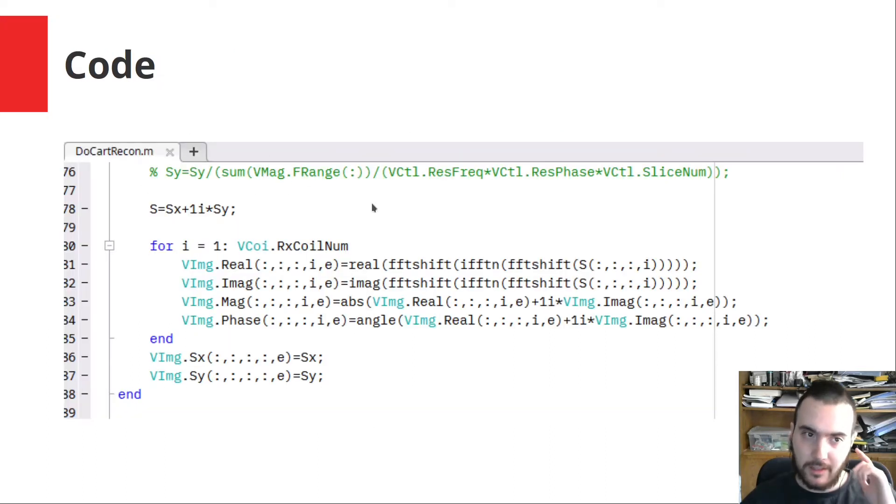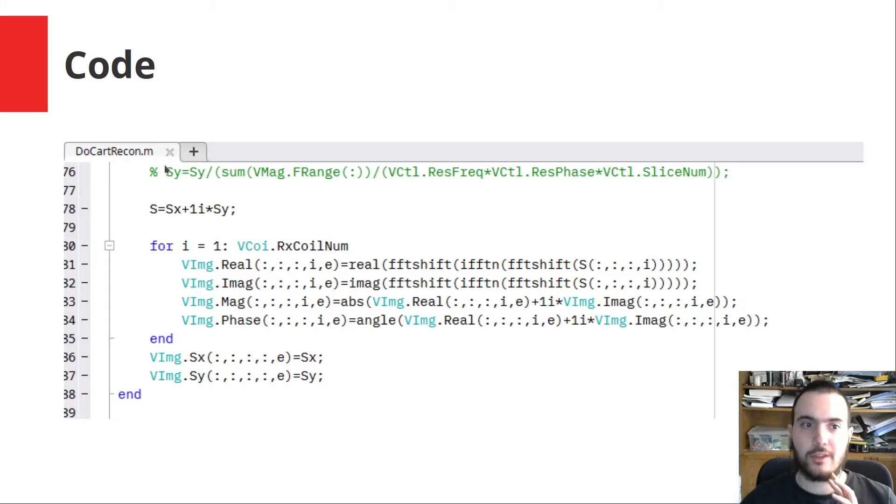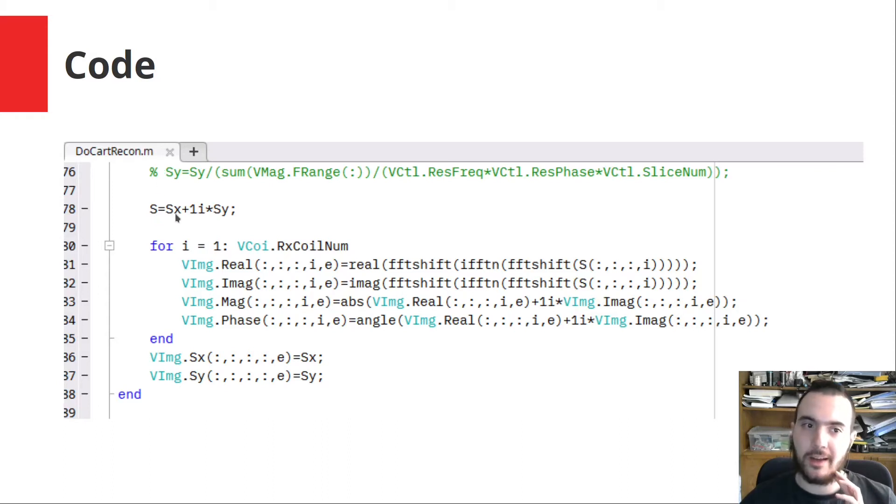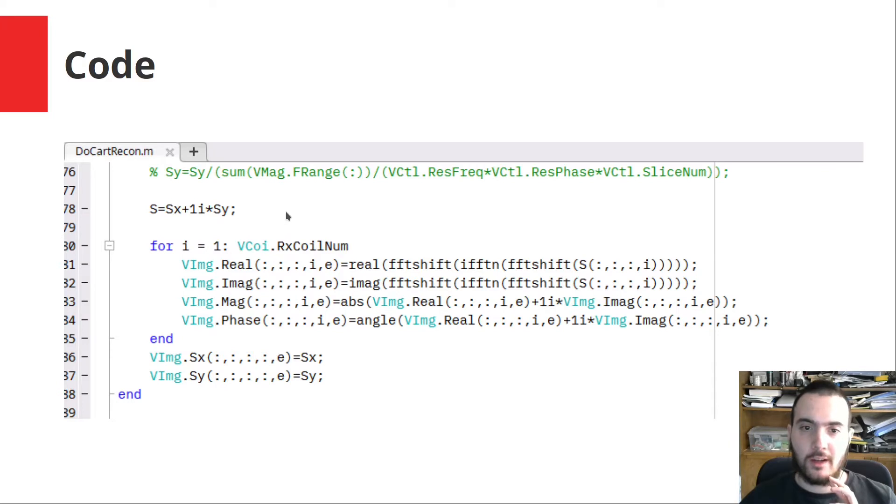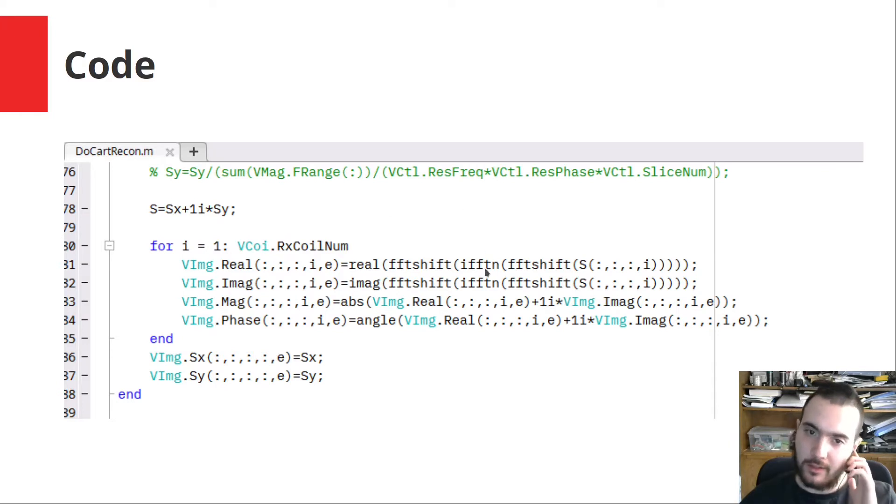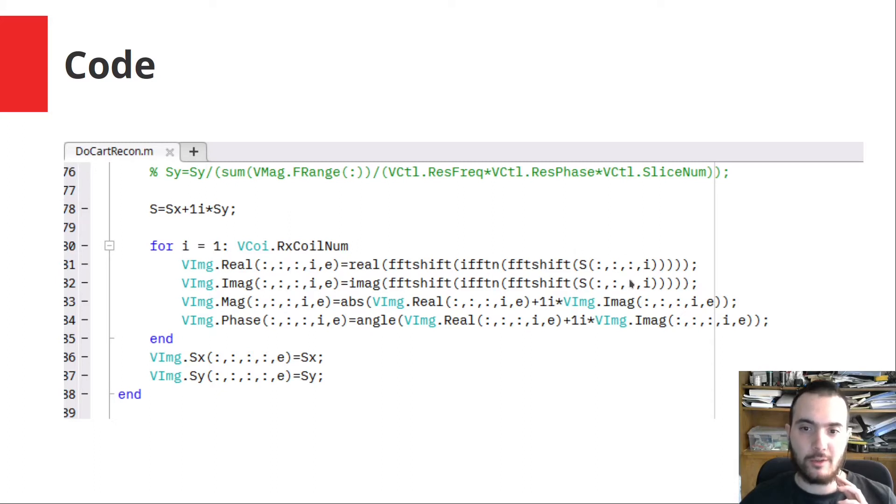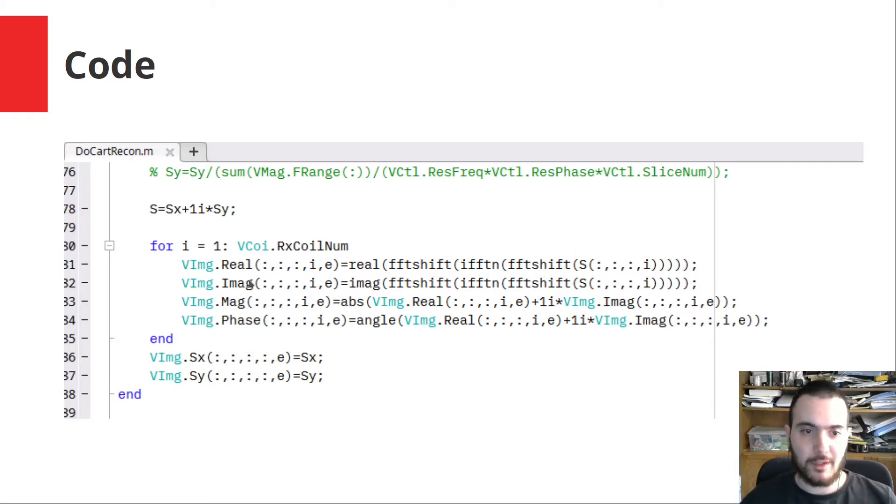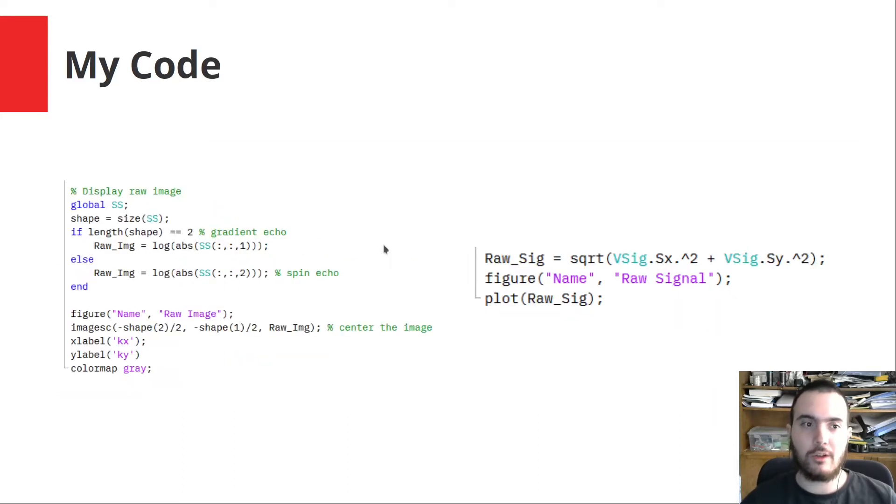Here is the existing code in Cartesian reconstruction. The signal S is constructed by the in-phase and quadrature components, so it is a complex signal. And then to build the image, there is an inverse Fourier transform done on the signal, so that we have the image with the real and imaginary parts and also the magnitude and phase. This is the existing code.